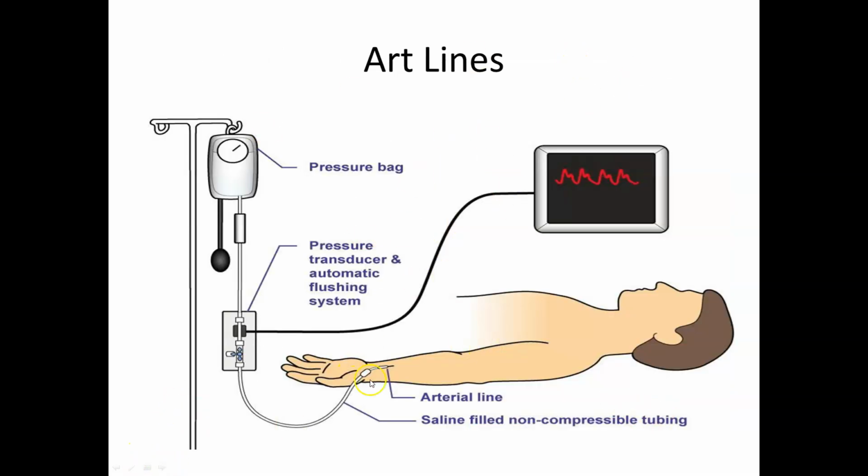So again, here just kind of the setup, what we see. You see the waveforms on the monitor. They're going to line up with what your PQRST kind of look like. You see the pressure bag. You see the transducers. You're going to have to do some leveling out once you're in one of those high-speed, critical areas. I'm not going to talk a whole lot about it, but it requires the nurse to do things to make sure that we are getting accurate readings.